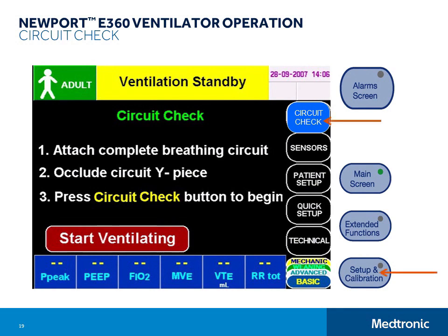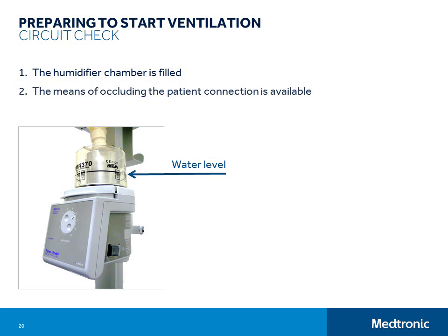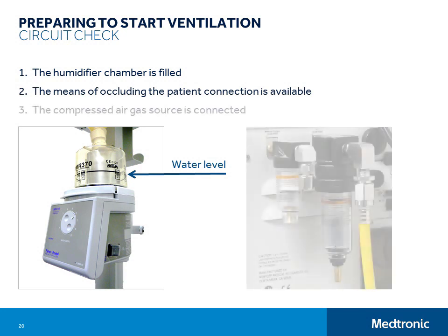The circuit check requires that the E360 be connected to a compressed air gas source, and the oxygen sensor calibration requires that the E360 be connected to a medical grade oxygen source. When the ventilator is powered on, it automatically goes to the circuit check screen. But if you navigate away from that screen while in the standby condition and need to get back to it, simply push the setup and calibration button on the panel and then touch the circuit check button. Before you start the circuit check, take a moment to make sure that the humidifier chamber is filled to an appropriate level and that you have a means of occluding the patient connection of the circuit. Make sure that the compressed air gas source is connected and turned on. Failing to connect a compressed air gas source will cause the circuit check to fail.